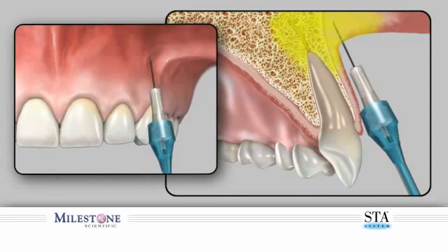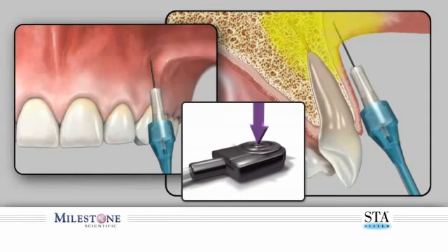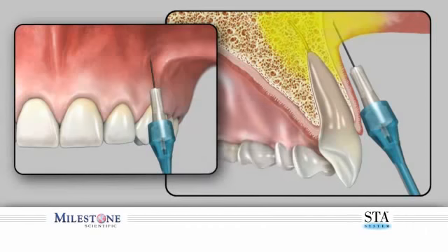To enter into the rapid flow rate, depress the foot control pedal beyond the halfway down position. This will allow you to enter into the second, more rapid flow rate, in which you can administer the remaining amount of anesthetic solution. This should only be used after your patient indicates that effective soft tissue anesthesia has occurred. When you have delivered the required dosage, you can remove the needle.